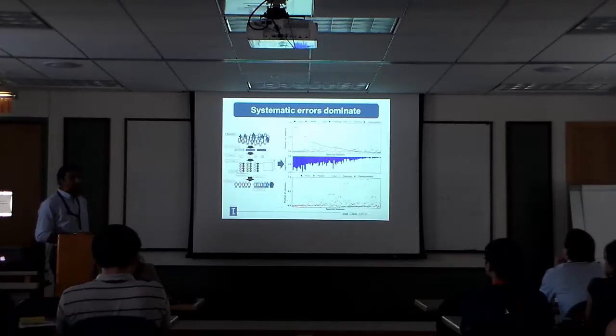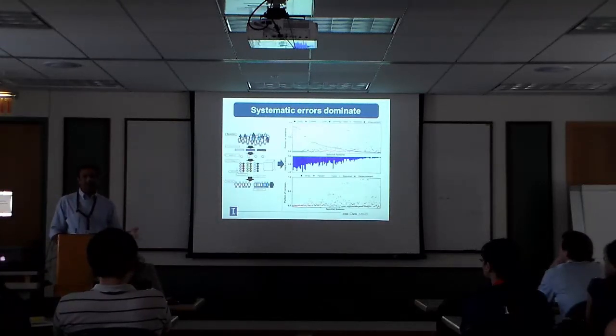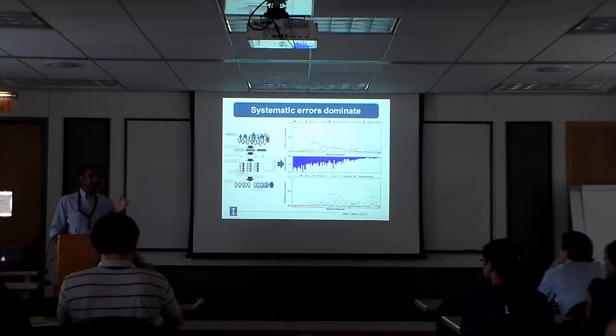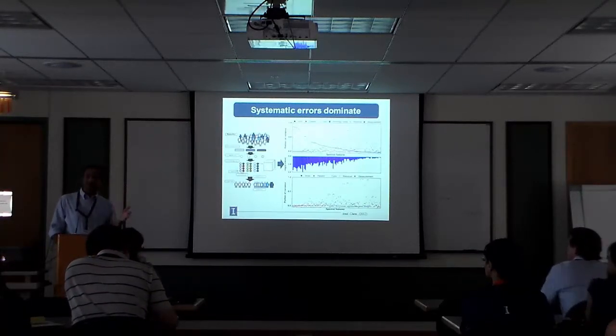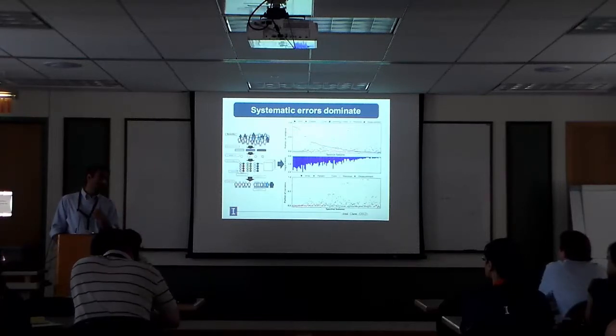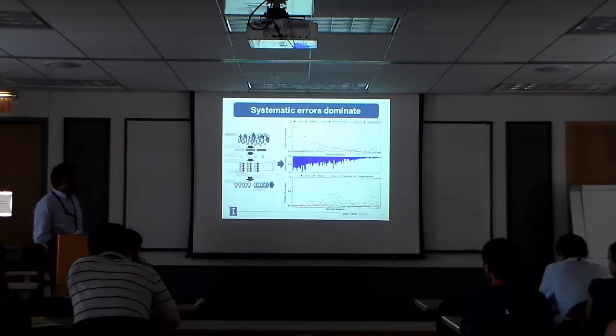But here's the money slide. It turns out what happens is if you acquire the whole spectrum for something, and once the results were in, we said, yeah, of course, that makes sense, right? It turns out that every frequency has an individual mind of its own. So every frequency or every spectral feature is influenced differently by different conditions. There might be some spectral frequencies that have a wide variation between person to person, right? So you can't really use them for disease diagnosis. There might be some that have a very low variance between person to person, and those are perhaps useful in figuring out if there's a physiologic difference in the tissue or not, right? So again, those things are doable.